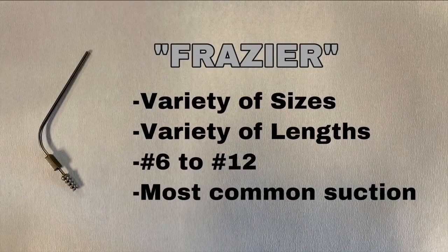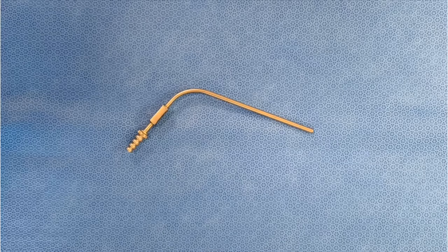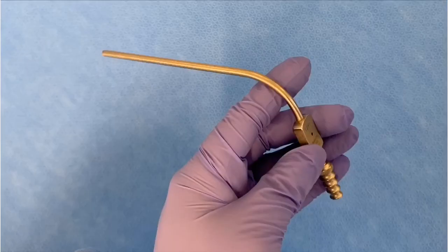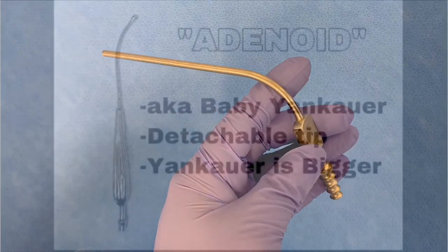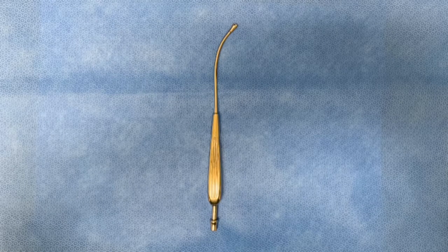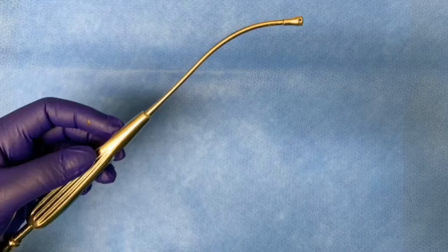This is the Frazier suction. It comes in a variety of sizes and lengths; common sizes are number six to number twelve, and this is the most common suction in the set. This is the adenoid suction, also known as the baby Yankauer. The tip can be detachable, and the Yankauer is usually bigger.